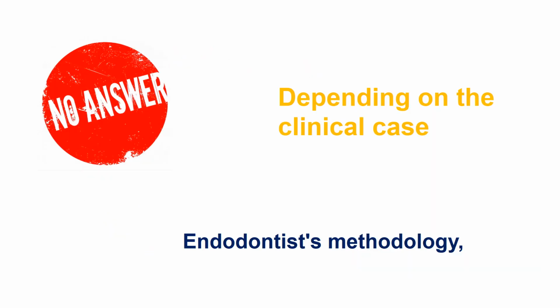There is no such answer to which file system you should use, because it totally depends on the type of case which you are doing. It also depends on the endodontist's preference and methodology, which method he likes to use, step back or crown down, or any hybrid technique. So there is no perfect single answer to which file system is better. It all depends on the practitioner's capability, the practitioner's preference, and the different types of cases.